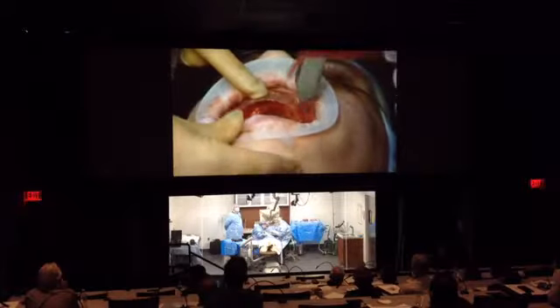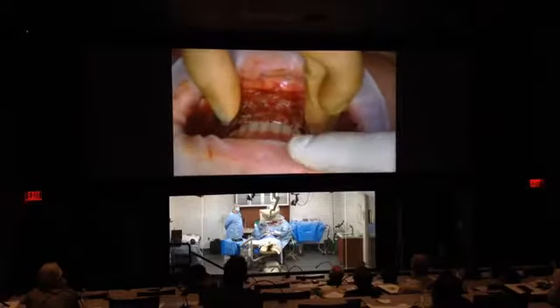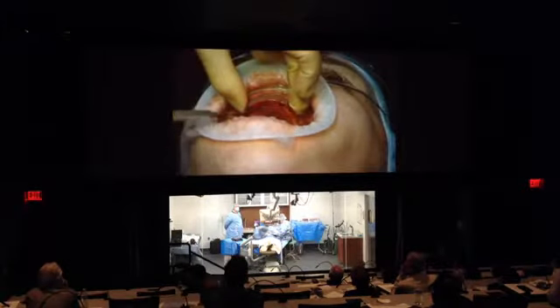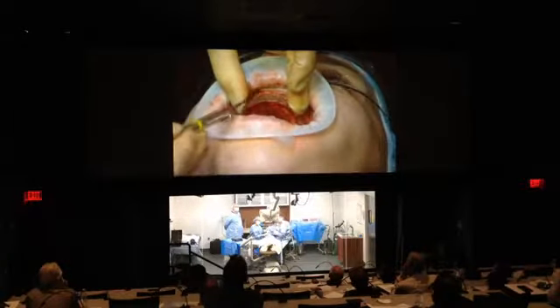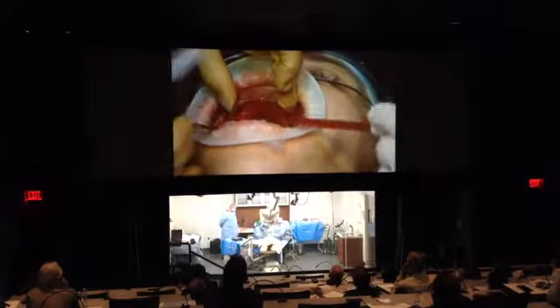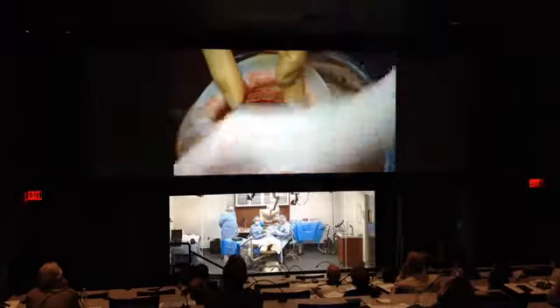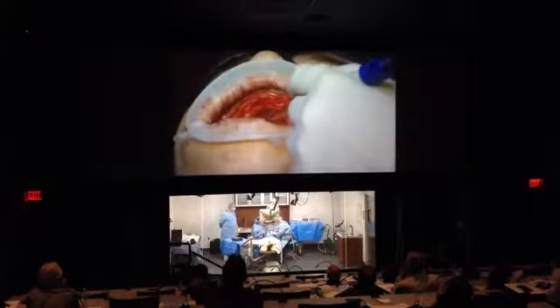Go ahead and bite down, close your teeth together. Perfect. Okay, so I know here that the denture is in the right place. Open again. I'm seeing basically about a 5 millimeter difference here from the flange to the ridge. So I know how to angle these implants, because we don't want too thick of a prosthesis in the anterior. It's going to make it difficult for her to talk if we place these implants too lingual. But on the sides, I'm good. You can probably see the bone right in there. So now I have a mental image of where that should be.